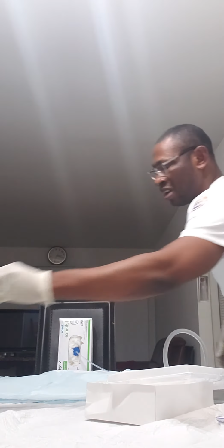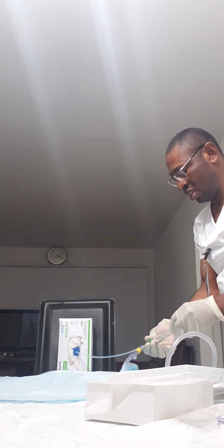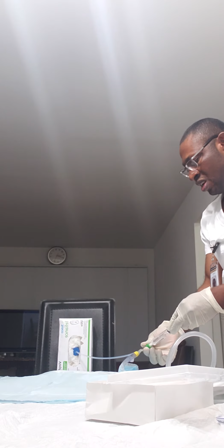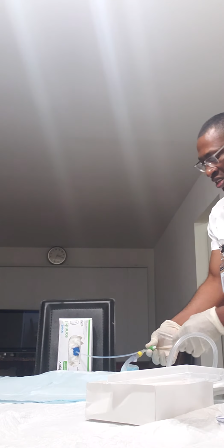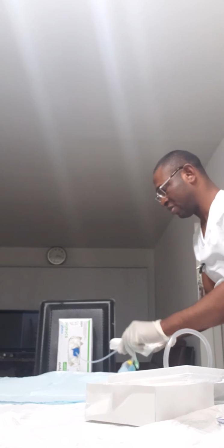The first thing I'm going to do is deflate. Open this, draw it and deflate it. After deflating it, lock it, trash it. After trashing it, I use a paper towel and get this out.